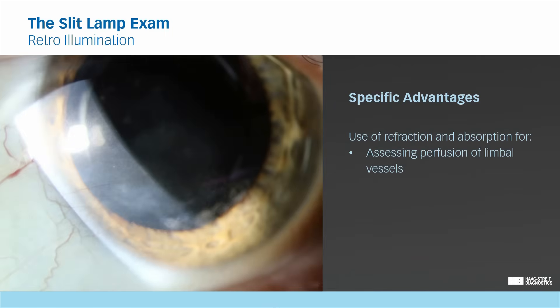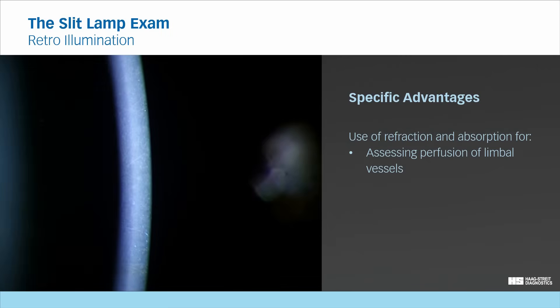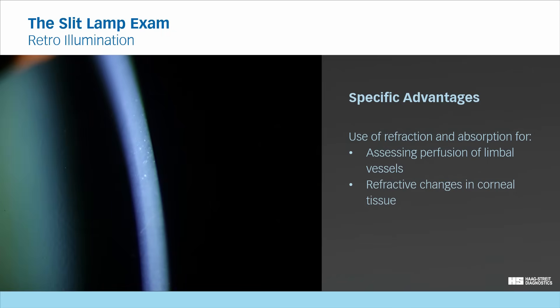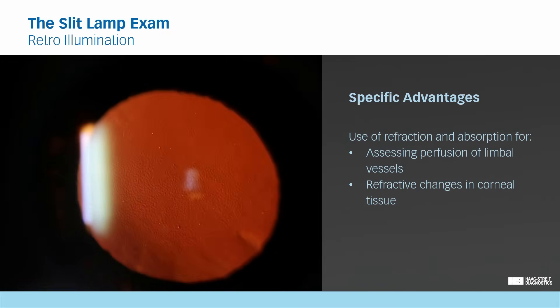The information with direct illumination would be much more limited. In this cornea, direct illumination shows the difference between the anterior and posterior cornea, but does not illuminate the irregularities associated with the corneal dystrophy. However, when utilizing indirect illumination reflected from the lens, you can observe the refractive changes it has caused in the cornea. When using the retina as the source of reflected light, the irregular refraction in the cornea provides an overview of how the central cornea is affected.